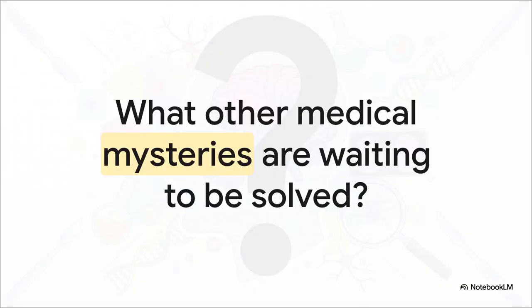We cracked the case. By using a systematic, detective-style approach, gathering clues, checking the case file, looking for that smoking gun, we can take a really confusing, suspicious spot on a scan and turn it into a specific diagnosis. It just goes to show you, even the most complicated medical mysteries can be solved if you just know how to look for the clues. Makes you wonder, what other secrets are hiding in there, just waiting for a good detective to find them?